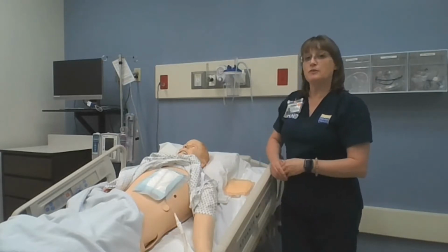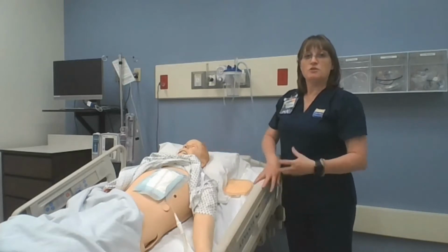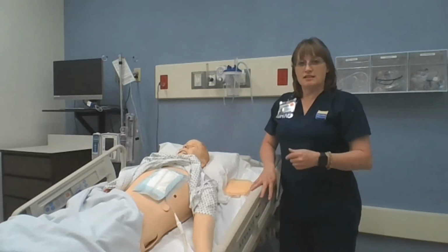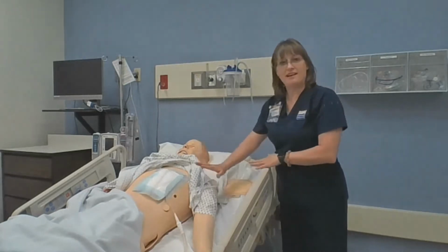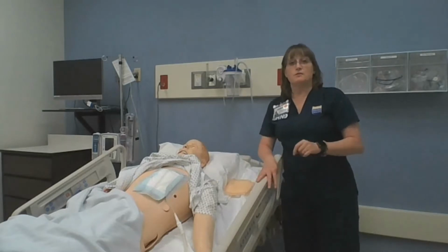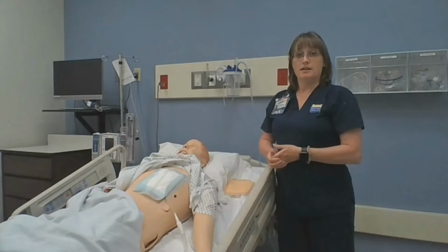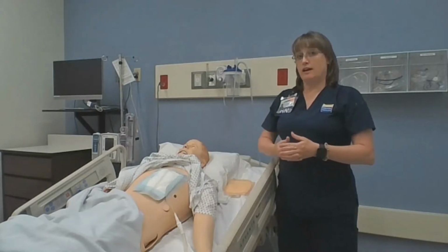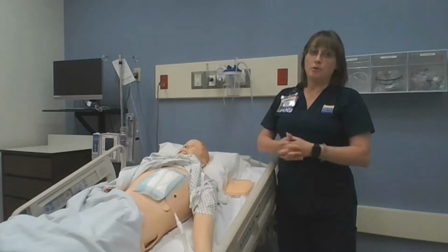So the very first thing you're going to assess when you have a patient with a chest tube is your patient. Chest tubes are intimidating, but they are, in a sense, just a drain. So you don't want to forget that there is a patient attached to the end of that drain. So the very first thing you're going to assess is, are they breathing? How are they doing? Because that chest tube is going into the pleural cavity and it's draining either fluid, blood, or air, or a combo of all of that.